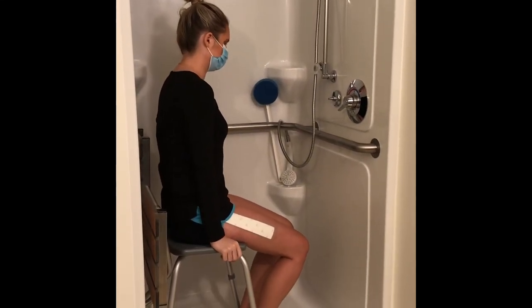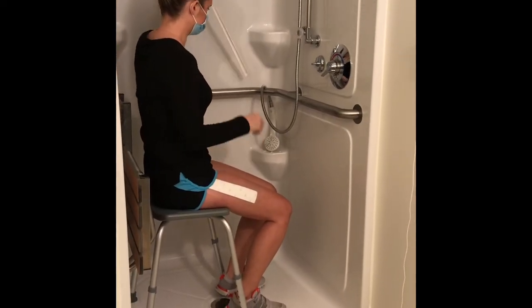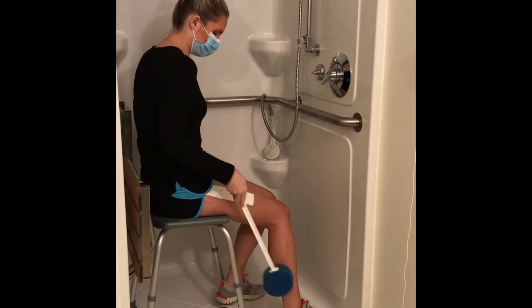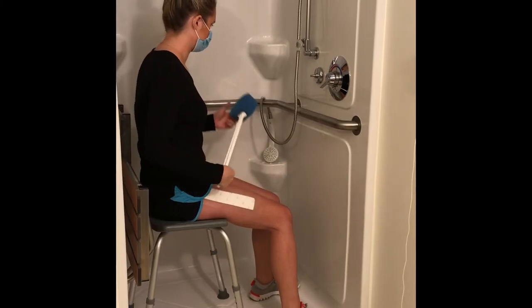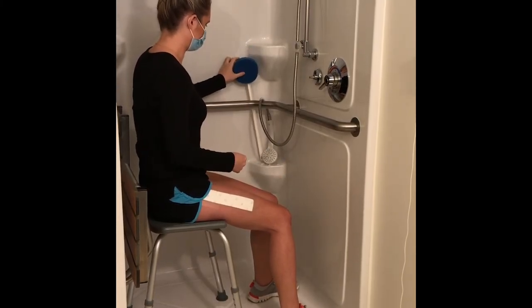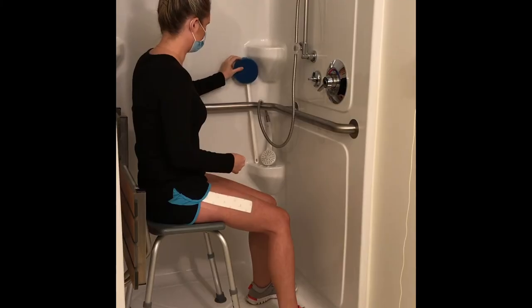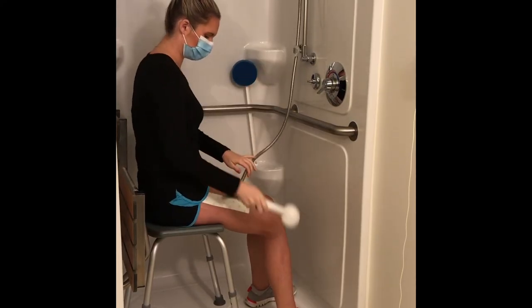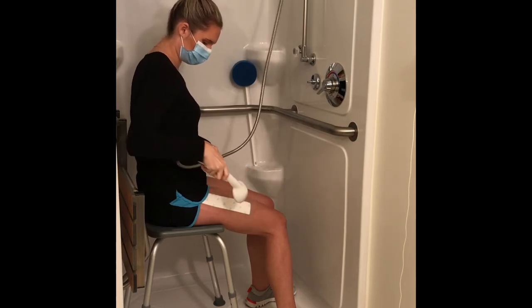Use a long-handled sponge for washing your lower legs, feet, and back. Be careful to avoid bending or twisting your surgical hip while bathing. Move soap and sponges within reach so you don't have to twist or reach below your knees. A hand-held shower hose is also helpful for getting clean without bending. Let soap and water run over your incision and bandage — no scrubbing.